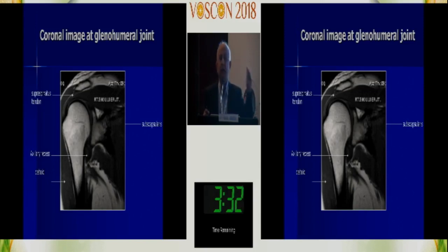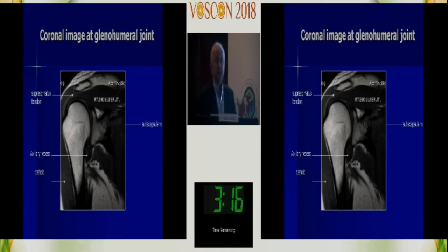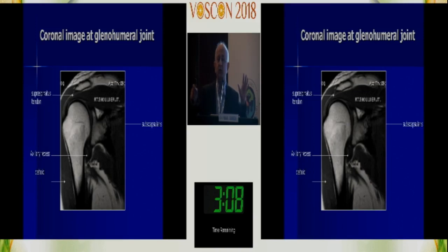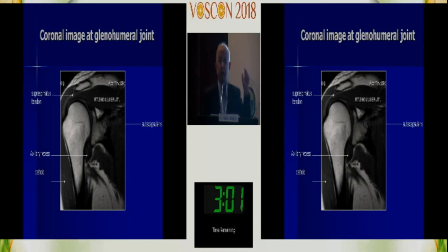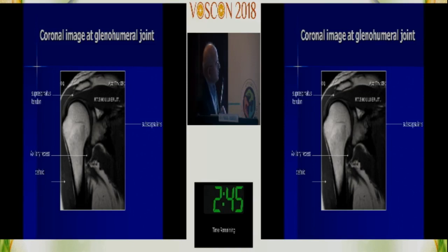Remember this as a gospel truth: in all images, the marrow is always bright, and the tendon is always dark. On T1, PD, and STIR, marrow is always bright and tendons always dark. You need a system in place — just like reading a chest X-ray in MBBS. Each radiologist has their own system. I find it easiest to go from top to bottom and out to in — that way you've seen everything and aren't missing pathology. Others report by structure: bones, soft tissues, ligaments, and labrum.